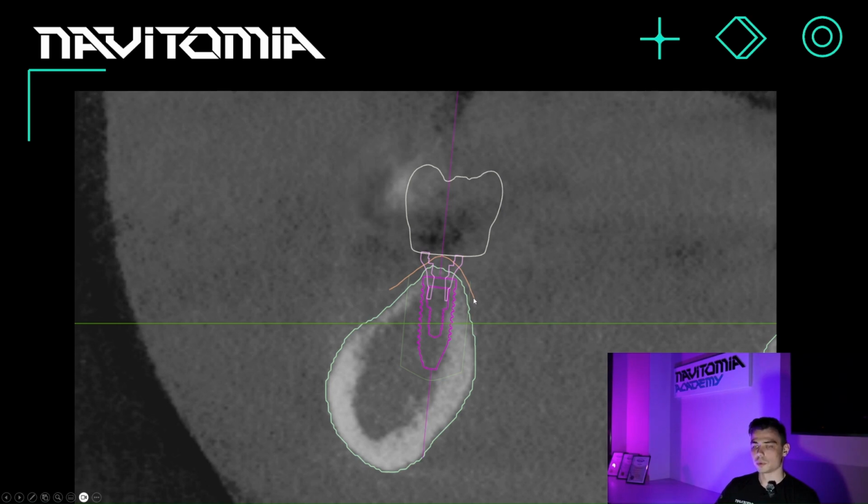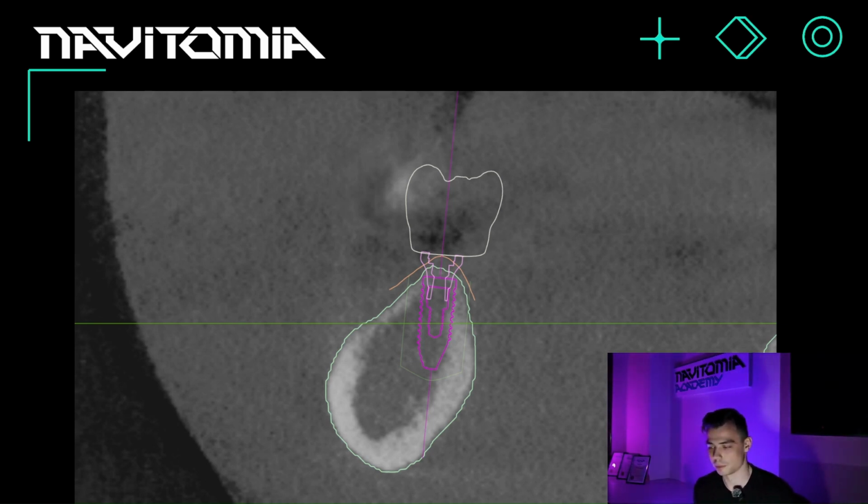It is very important to position implants correctly and to place them according to the bone, because in fact that is what you are doing. Your task, the main goal of all surgical guides, is to transfer what you have planned into reality, into the oral cavity. And a good surgical guide is one that transfers everything from the planned position into reality. Even if you modeled everything terribly, at least from a surgical standpoint, that's why our task is, you could say, to kill 2 birds with 1 stone. That is, to position the implant well, to plan it properly, and to make the guide in such a way that this position is accurately transferred into reality.